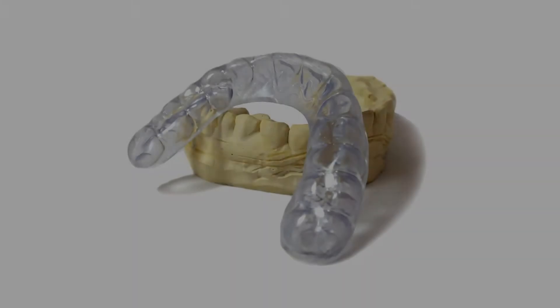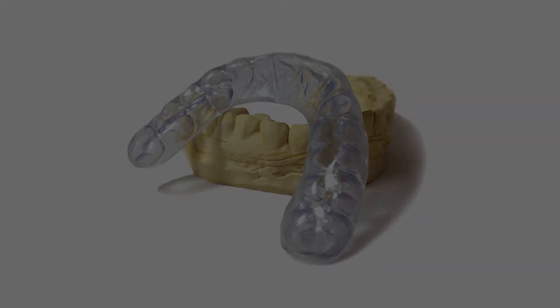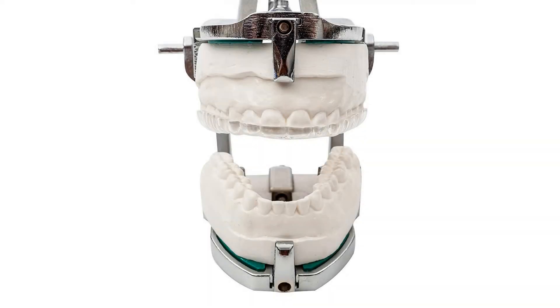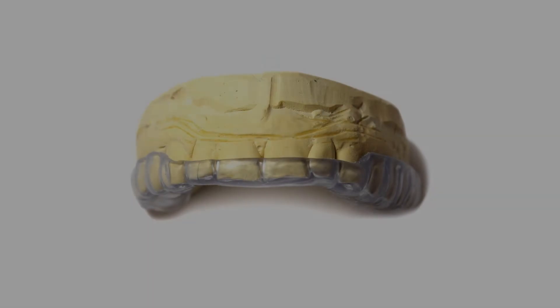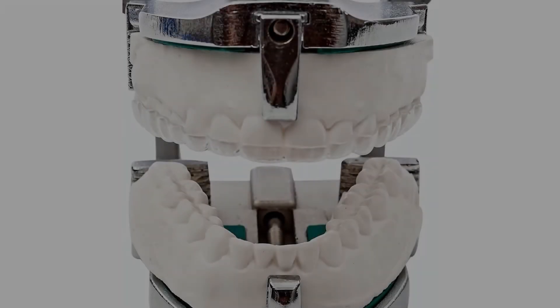Approved by dentists. Fully customizable mouth guard — choose from soft, semi-hard, to all-hard night guard. Thickness ranges from 0.06 to 0.16. Lasts up to 5 years depending on use and teeth grinding habit and severity.